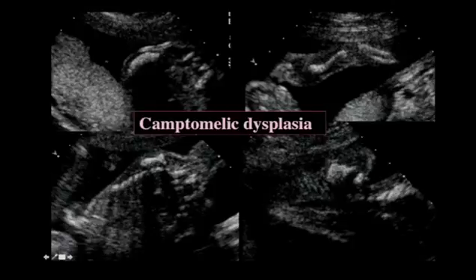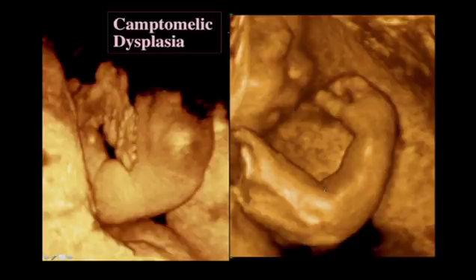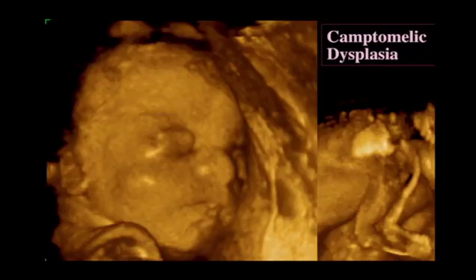There are some measurements that you can look up for scapula measurements, but that's not quite as visual as the difference between a relatively normal upper extremity and a very, very bowed, short, and almost pretzel-like lower extremities that's associated with camptomelic dysplasia. In this third trimester fetus, you can see that quite dramatically. And you can see the faces are rather unusual, but what you can see here is how small the scapula is. And if you were to measure it, it would measure under the 5th percentile.